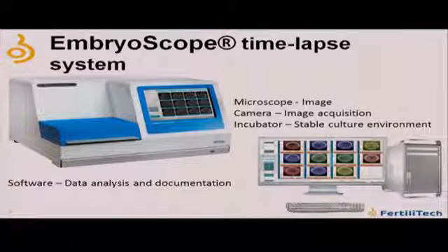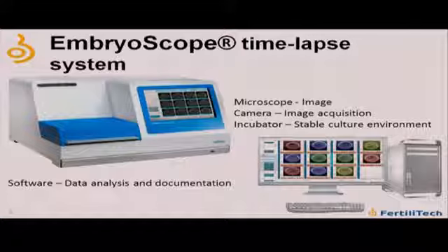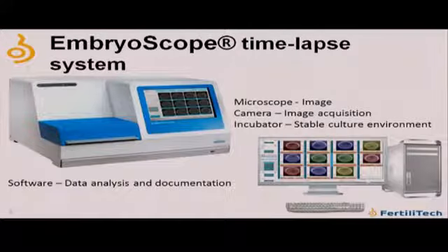If you can imagine, while the embryos are in culture in the laboratory, the embryologist or the lab person can check the embryos during development without having to take them out of the incubator, bring them to a microscope, and disturb the embryos, essentially putting them in a room temperature environment, and then put them back into the stable environment for culture. But not only can they watch the embryos during the development, they can also have these time-lapse videos later for analysis and documentation.